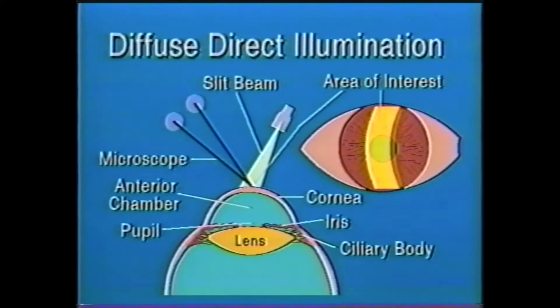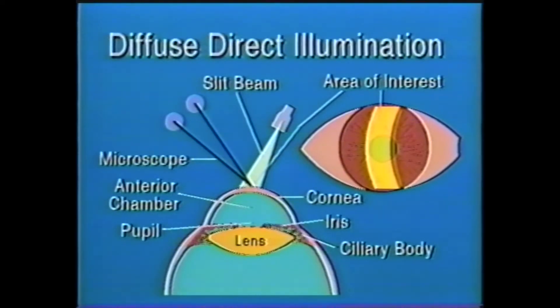First, diffuse illumination. This uses a broad light beam that provides a panoramic view, like using a flashlight. It is good for outlining large surface areas such as a corneal abrasion.